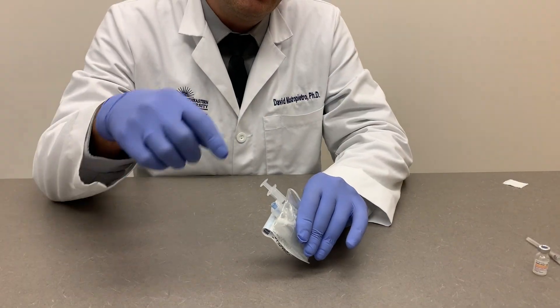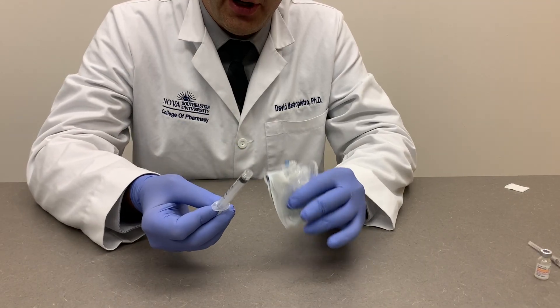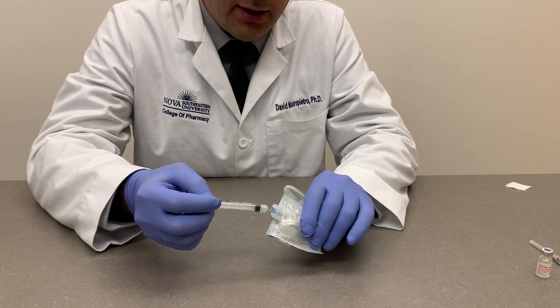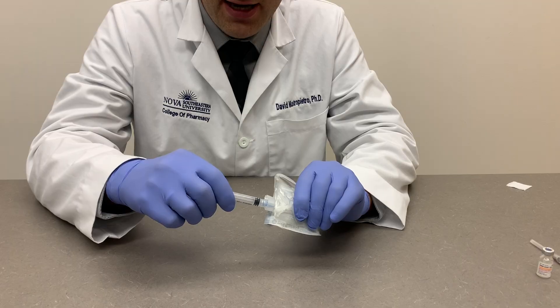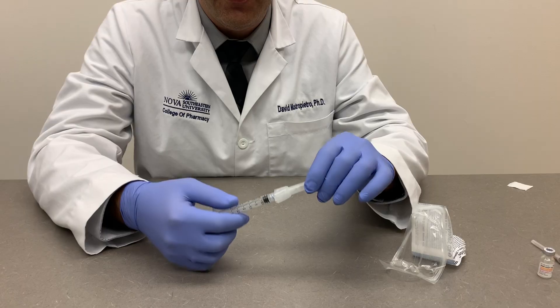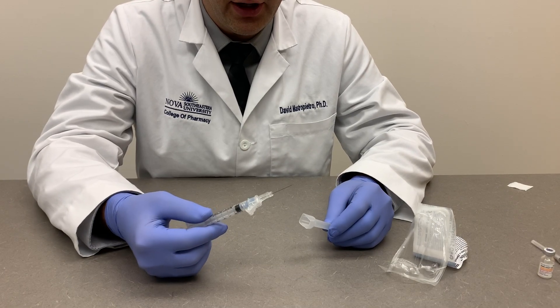If you have a needle and syringe packaged together, carefully remove the syringe — again, do not touch the tip of the syringe, which is the critical site. Quickly attach it to the needle using the luer lock for a firm attachment, and then the needle sheath can be removed.